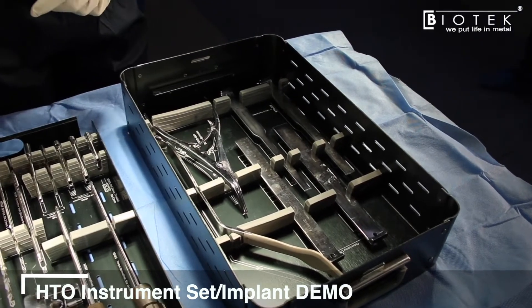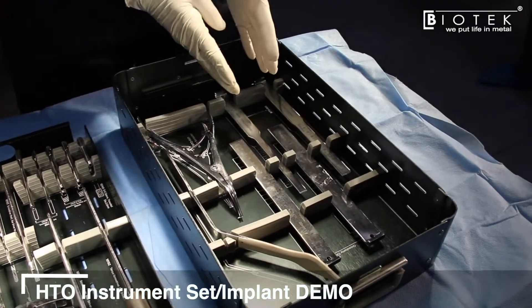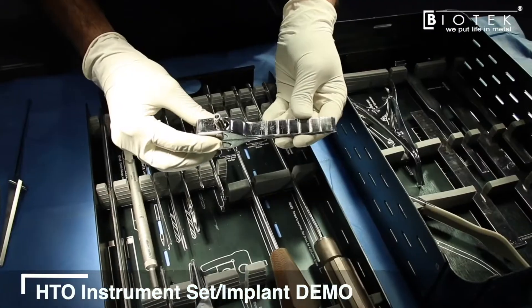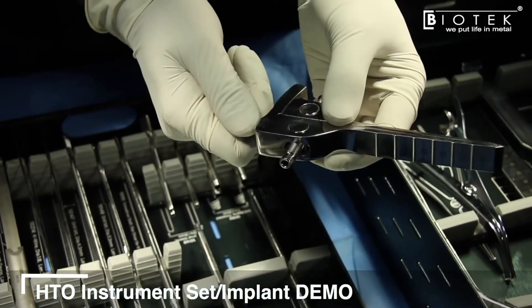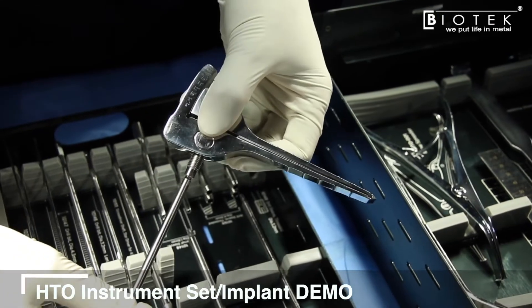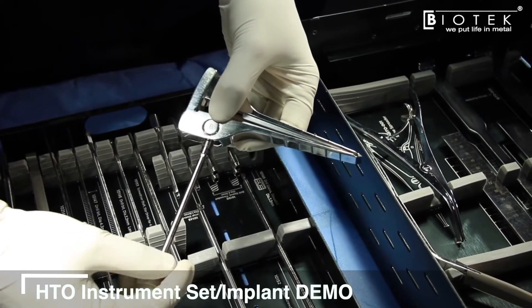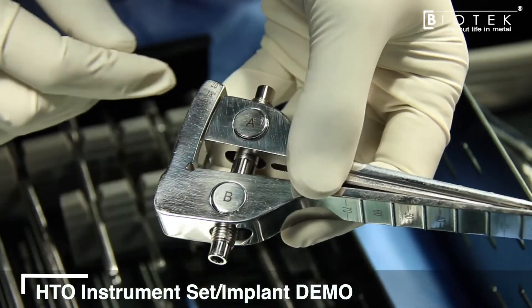For opening the osteotomy, you can use the stacked chisel technique or use the osteotomy opening wedge, which is malleted in slowly into the gap. A key is then used to gradually open the osteotomy under fluoroscopy control to the width planned during preoperative planning.